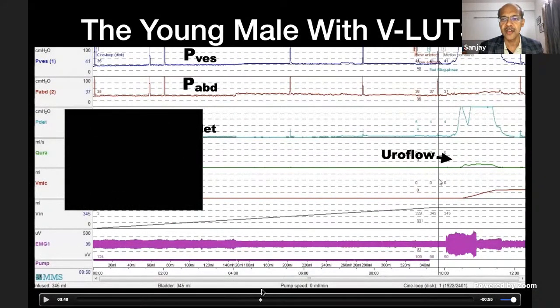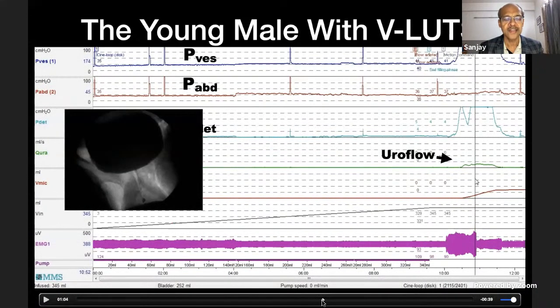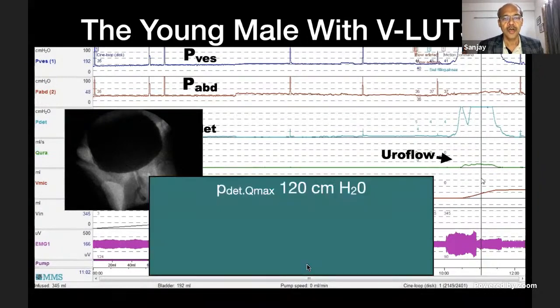this patient has voided. And you can see here that as this patient voids, you can see the bladder neck is closed. So there's a very high pressure and you can see a closed bladder neck. The prostatic urethra is not dilated. And this is characteristic of primary bladder neck obstruction. So although the EMG seems to suggest that it's a dysfunctional void, this is not a dysfunctional void. This is a primary bladder neck obstruction. And this patient should do extremely well with a bladder neck incision.